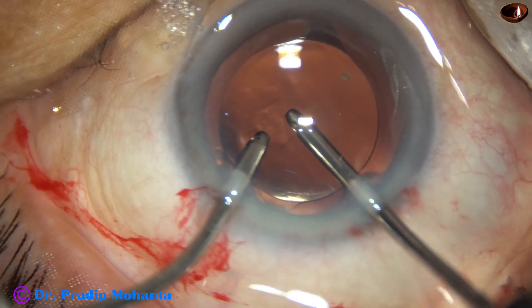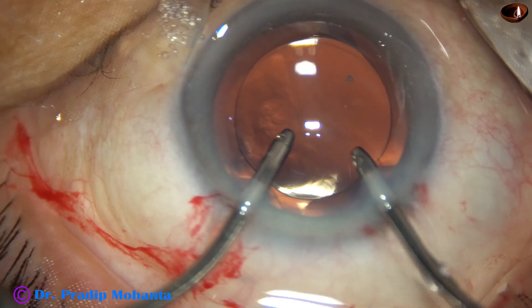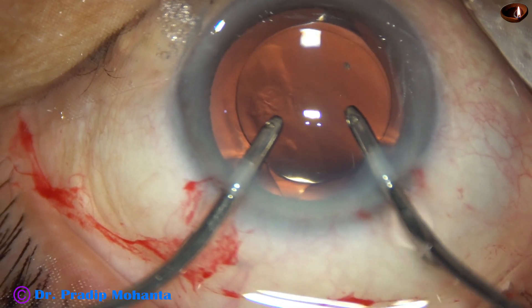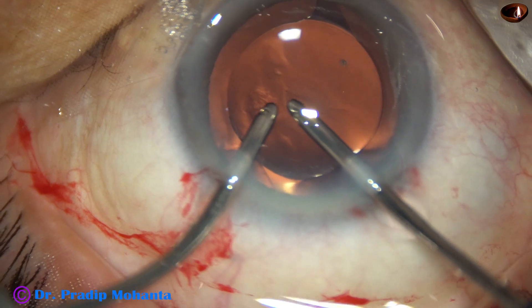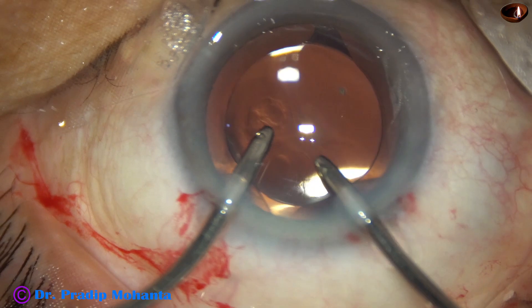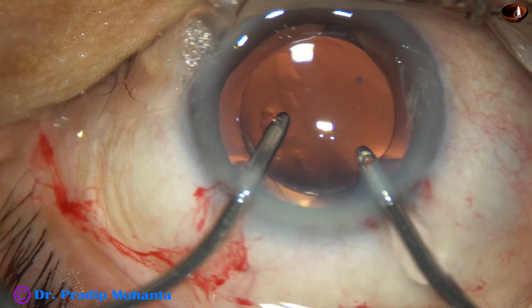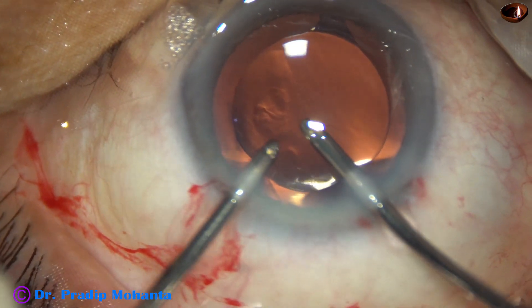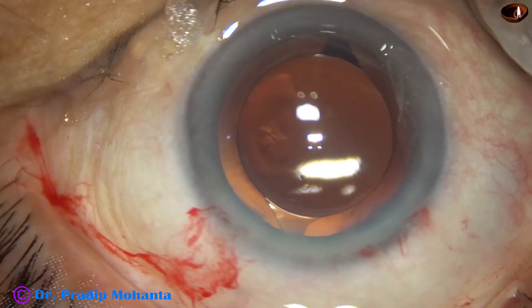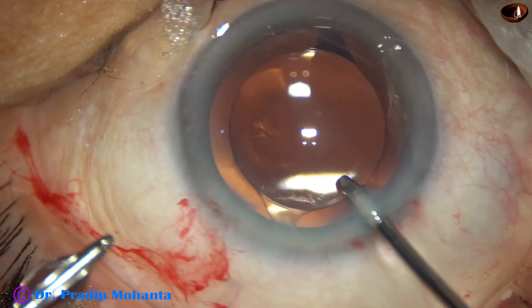I use the irrigation-aspiration for some time and most of the visco has come out. There is no vitreous prolapse in this case, so I do not want to use the vitrectomy cutter to remove the visco from the rent.